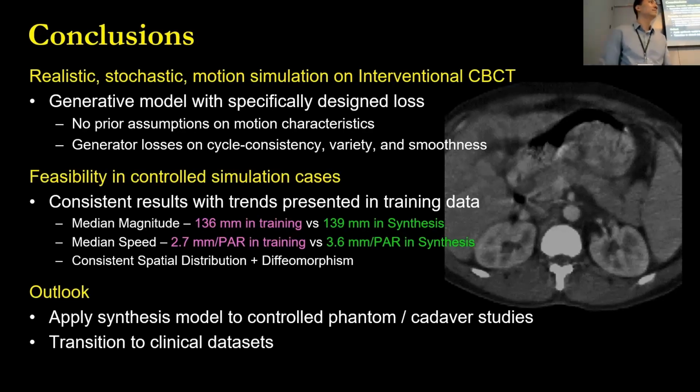Hello, great presentation. A question: have you compared your results to motion artifacts in real CBCTs, or visual comparison? And maybe another question: I would say that most of the motion artifacts are induced by respiration, and therefore why not use the deformation field from a 4D CT, for example, for generating this information for the simulation? Okay, sure. Let me make sure I understand your 2 questions right.